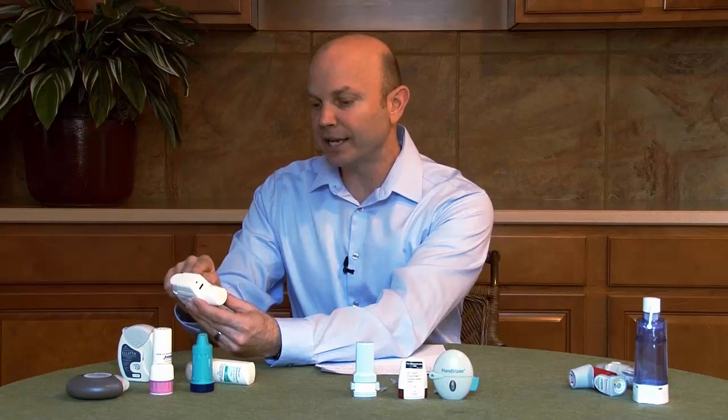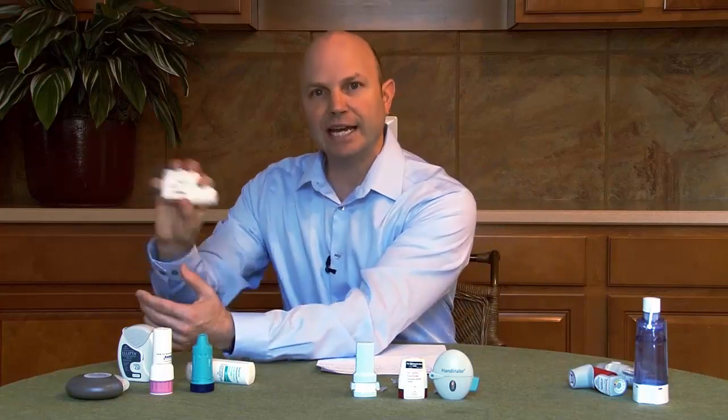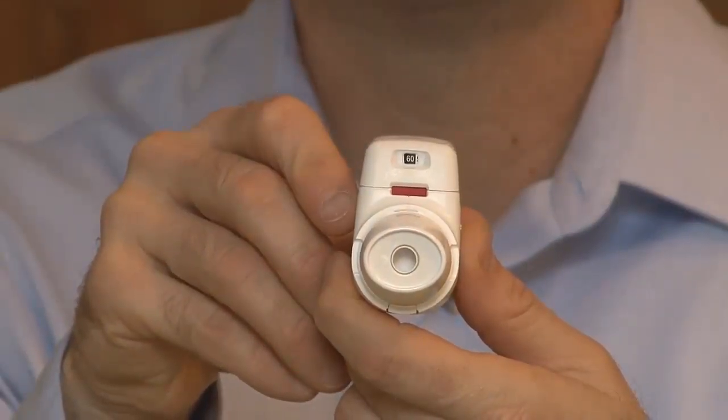The medicine is located inside of the device, so never take these apart to inspect to see if you're getting all the medicine. It's not designed to do that. The other thing to note about these devices is you never want to shake them like you would for the inhalers. If you shake these devices or you blow into them, you'll actually blow the medicine out of the device and you won't be able to inhale that into your lungs.